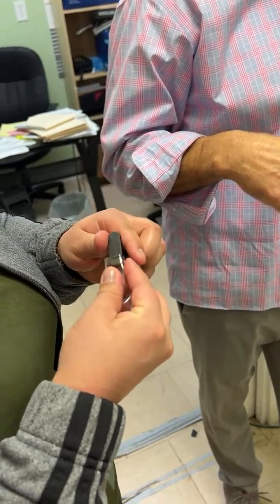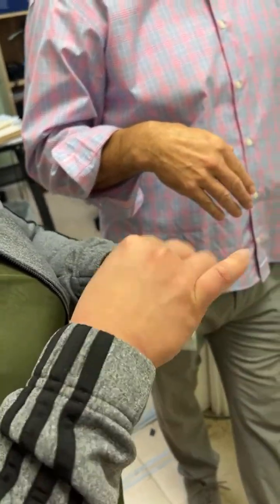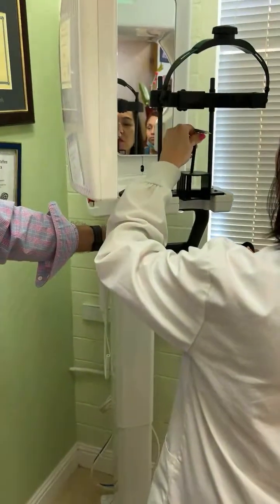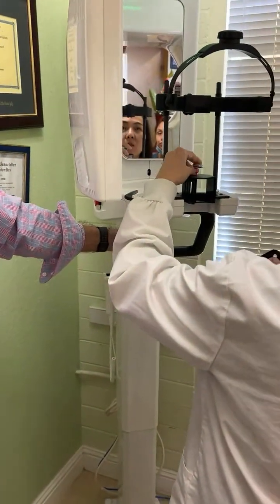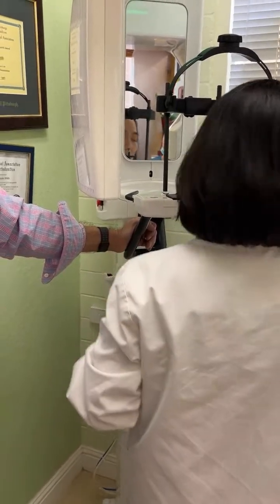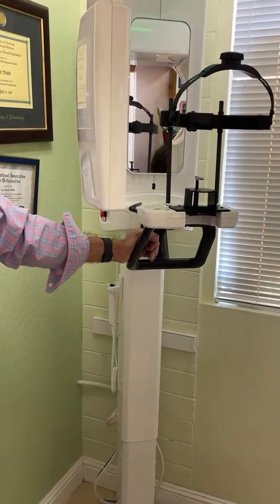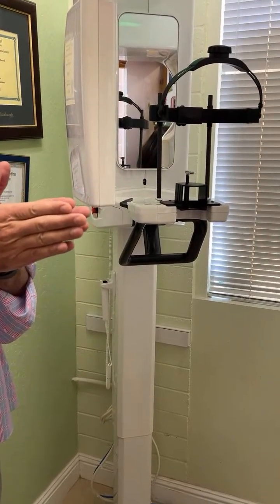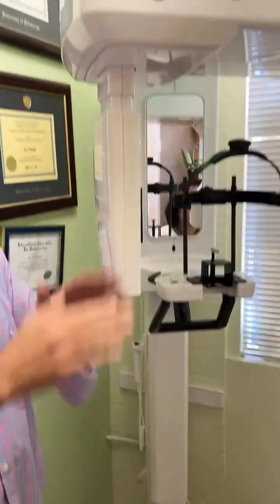And explain to the patient that it's not radiating you as much as the old machines used to. These are what we call collimated. The beam is very specific and refined, and it's going at an upward angle, and it's not hitting the gonads.